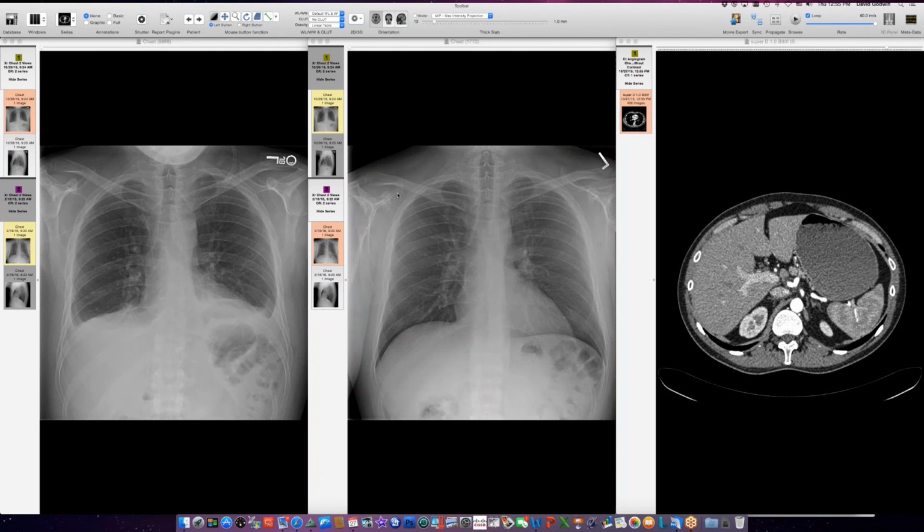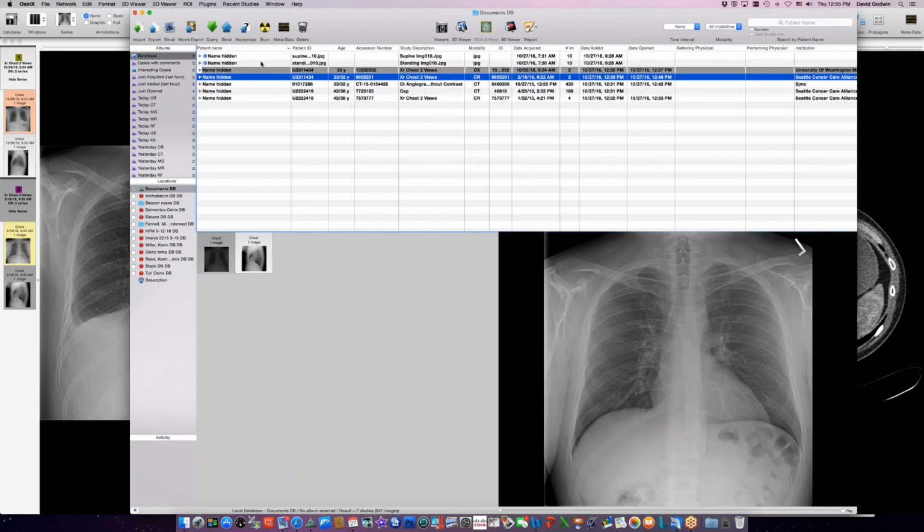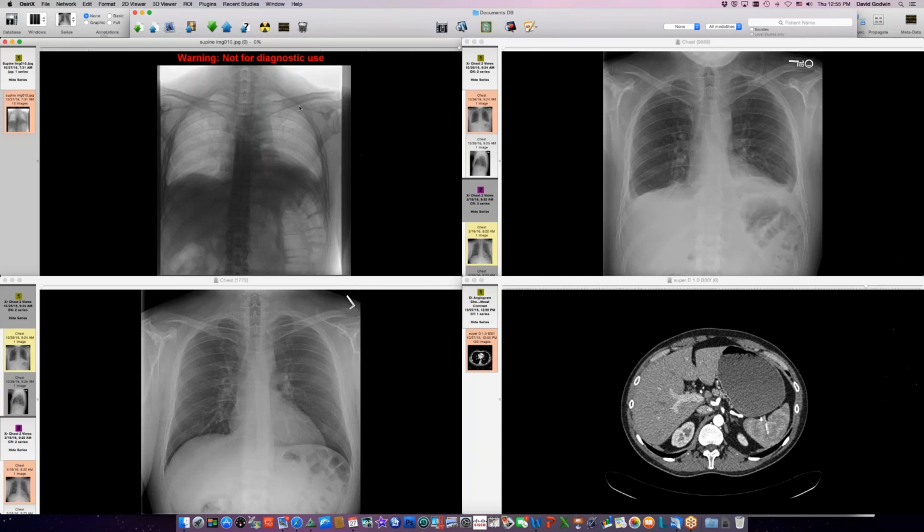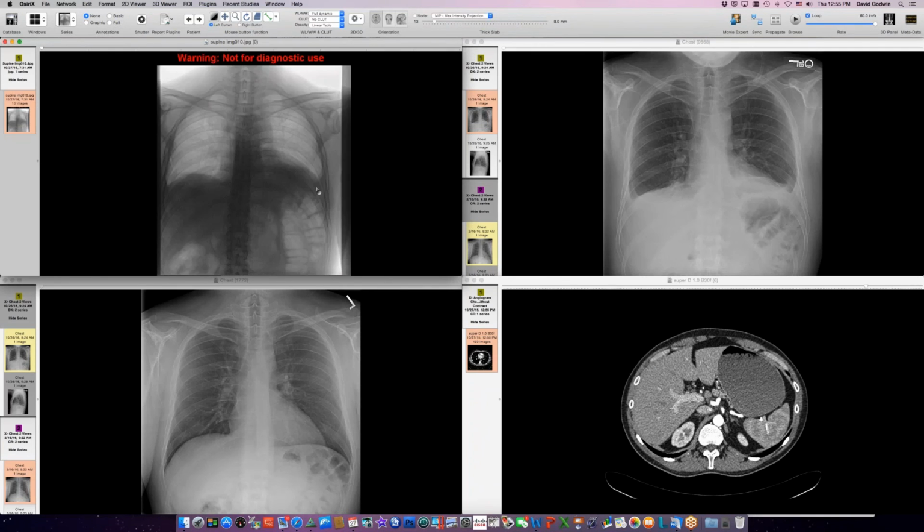Now I'd like to show you his fluoroscopy here. So this is fluoroscopy with the patient supine. I started with this patient standing. He's got the low lung volume, and he had a little bit of respiratory motion here when he breathes. Let me see if I can do this in a loop. You can see his diaphragm moves just a little bit here with him supine.